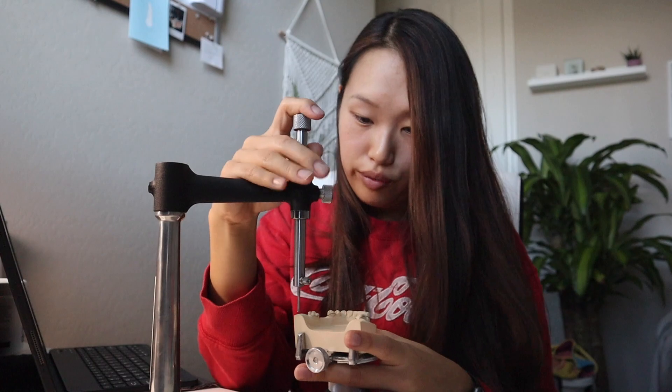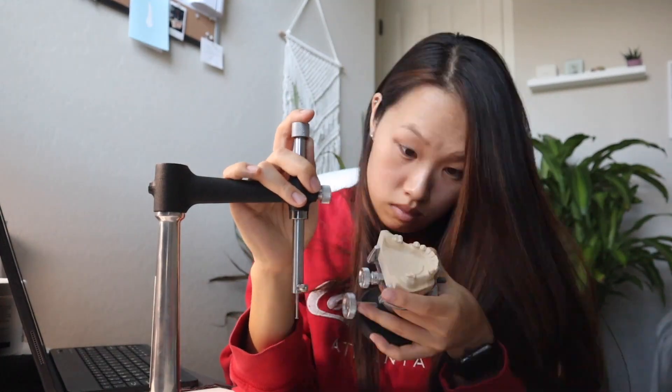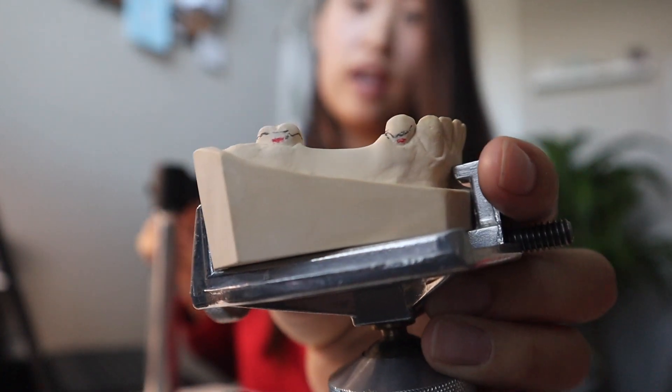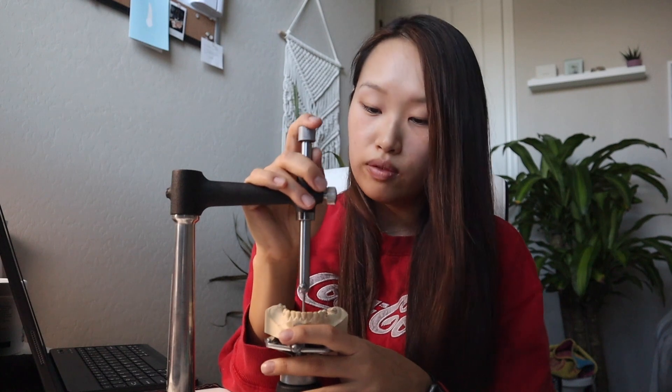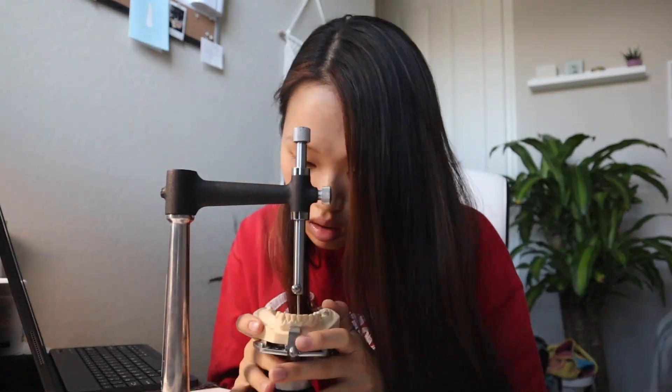So let me just mark the rest of the undercuts. You might be able to see it, you might not, but I marked it in red. Now I'm going to tripod the cast — I'm just going to mark where the undercut gauge hits the anterior, the right, and the left. The purpose of tripoding is to make sure that the lab tech can interchange casts. And then same thing, I'm going to mark these in red.